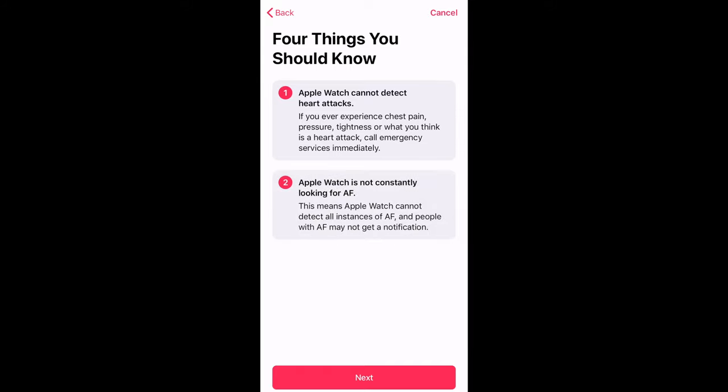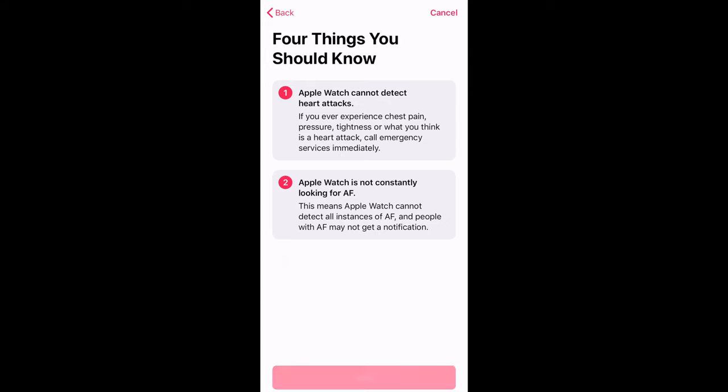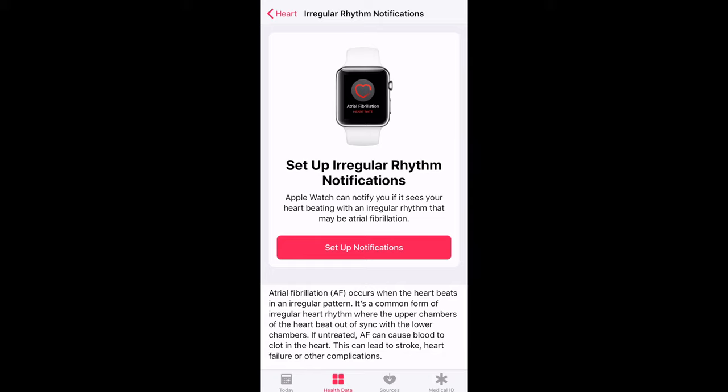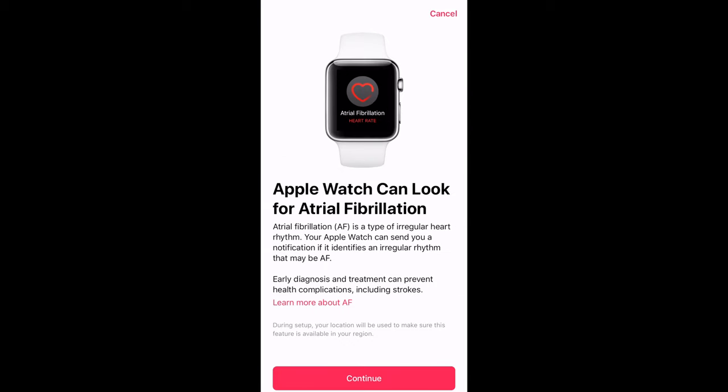You also have the option to set up irregular rhythm notifications, so the watch will constantly keep checking your heartbeats, and if it detects any irregular heartbeats, it will let you know.